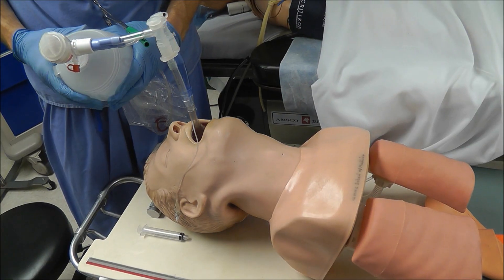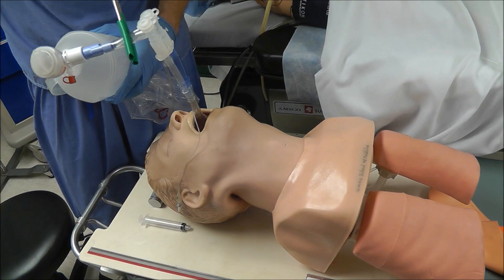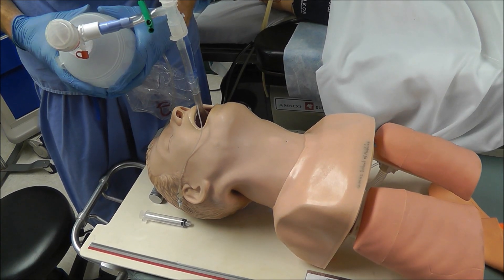Then if I go ahead and clamp the tracheal lumen, I should only hear breath sounds on the left side, and that's the case.